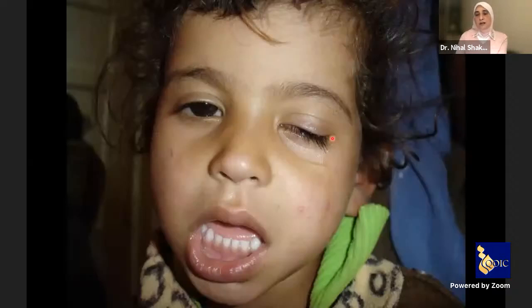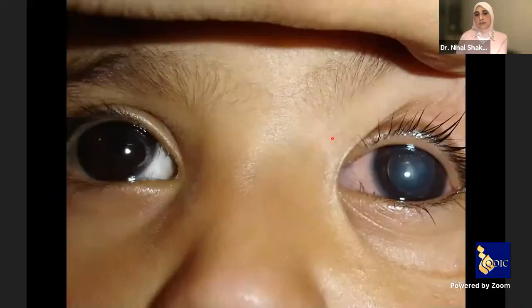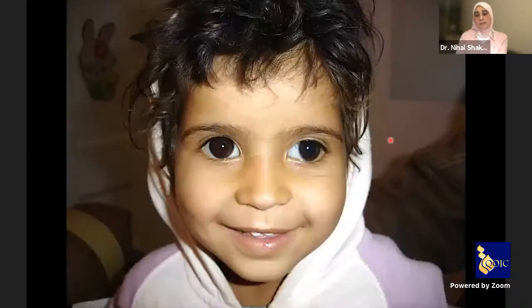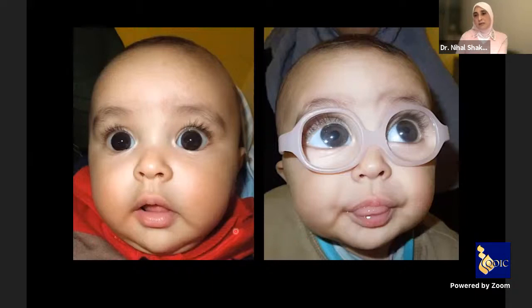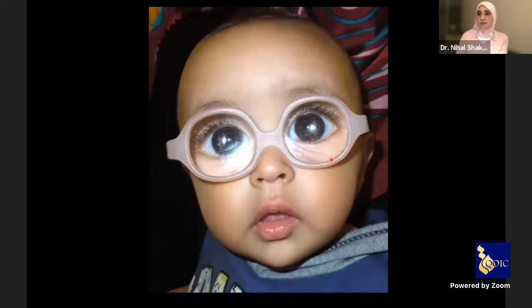This is a case with long-standing pupillary block glaucoma, shown here at conclusion of surgery. Immediately after surgery and a few months after surgery, the left eye pressure was controlled and we were able to save the right eye. By examining the patient's brother, we found he has the same condition. Immediately after surgery wearing aphakic spectacles, one year after surgery he was glaucoma-free.